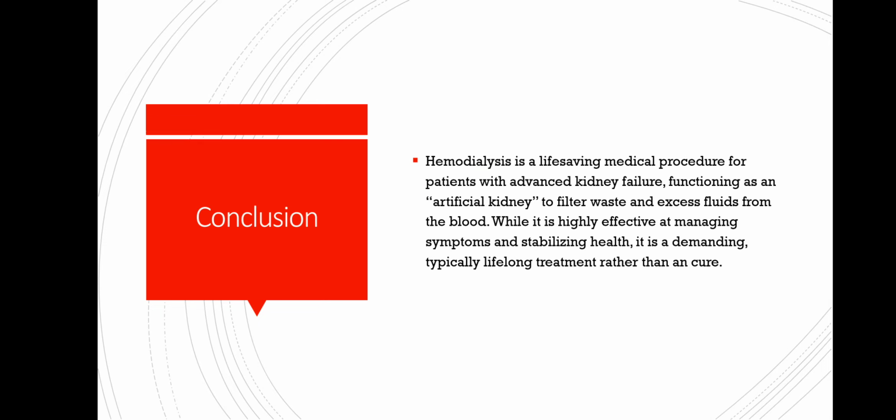Last one, conclusion of hemodialysis. Hemodialysis is a life-saving medical procedure for patients with advanced kidney failure, functioning as an artificial kidney.